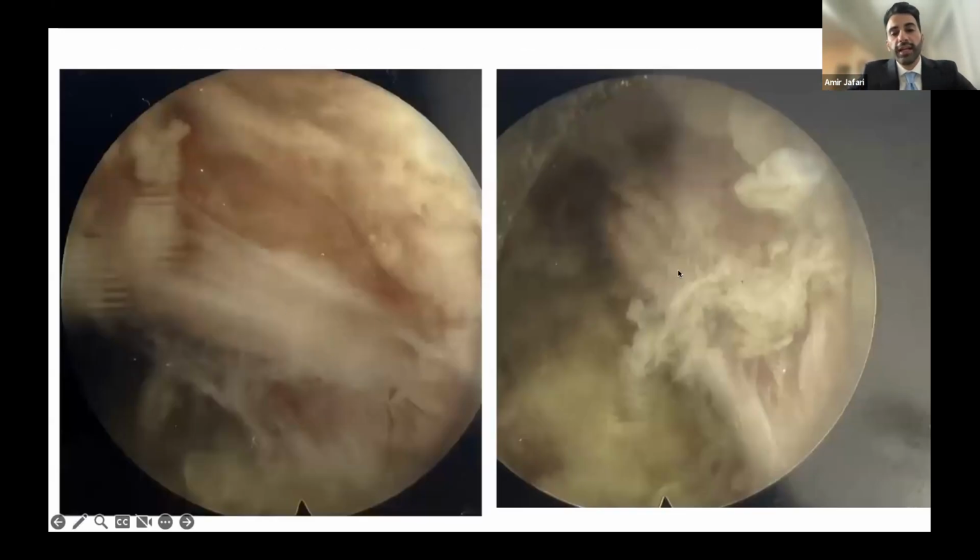Here's what the nerve looked like after. As you can see, this is the exiting nerve. As I said, I was visualizing it. This is how it's coming out the foramen. You could see I have freed up around it. I have decompressed all the disc around it. And this is, again, another image of the nerve. And you can see underneath it, there's a shadow. This wasn't there before. So we have freed it up.